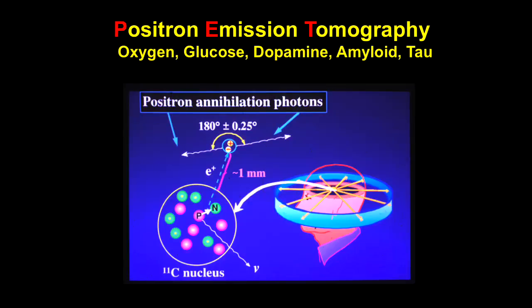is positron emission tomography. Extremely powerful tool in clinical medicine now. It had started being used in brain science, but now it's really used for diagnostic purposes. Very powerful tool, really simple. You have a radioactive, unstable nucleus. The different nuclei can be from different tracer sources. This unstable nucleus decays and emits a positron. The decay emits a positron, which is, basically, think of it as a positively charged electron.